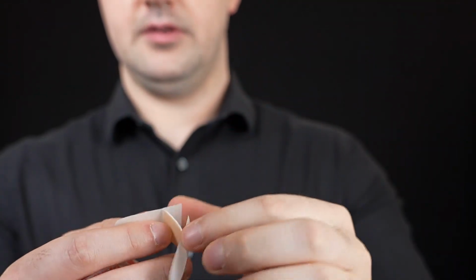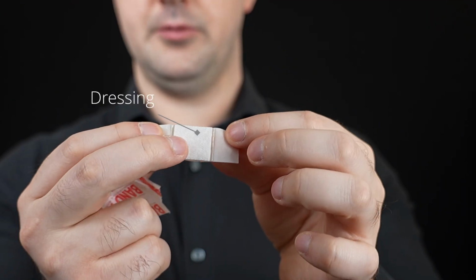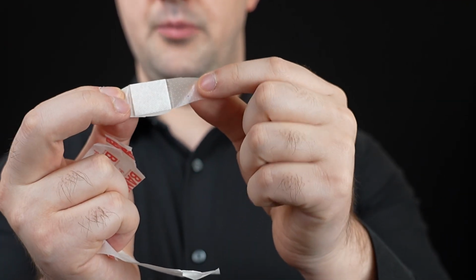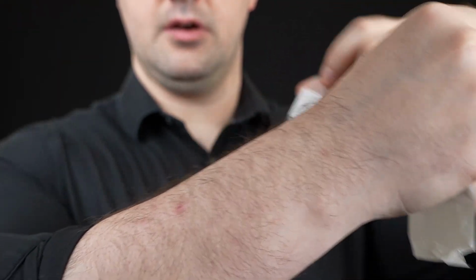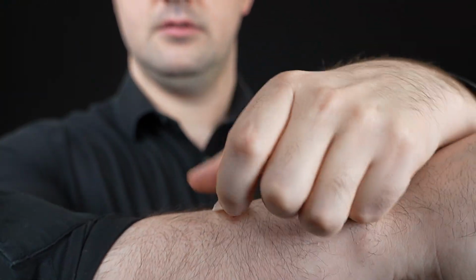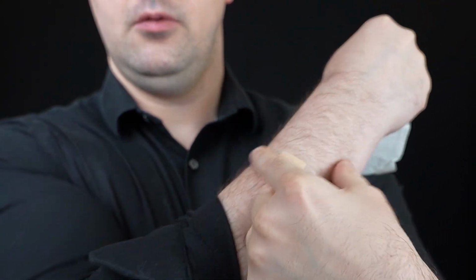So let's take a look at this for a second. So we've got that, right? Now the idea here is that you've got the dressing in the middle that goes on top of the wound, and then you've got the bandages that stick the dressing together. The Band-Aid secures the dressing with the bandages, okay? So this is a dressing and a bandage put together. We've got our Band-Aid. We also have dressing and bandage, okay?